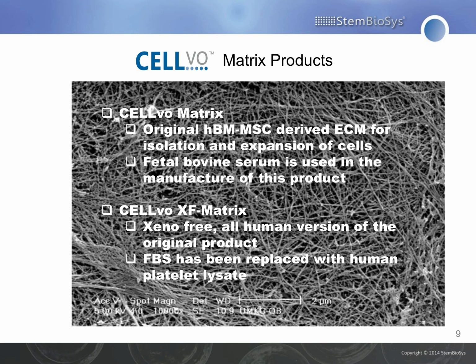So I hope that was much more clear in terms of the way that we process and build this extracellular matrix. And what I'm showing here on this particular slide in the background is, again, a scanning electron micrograph of what that finished product looks like. So you can see that extracellular matrix that's been built by the cells.